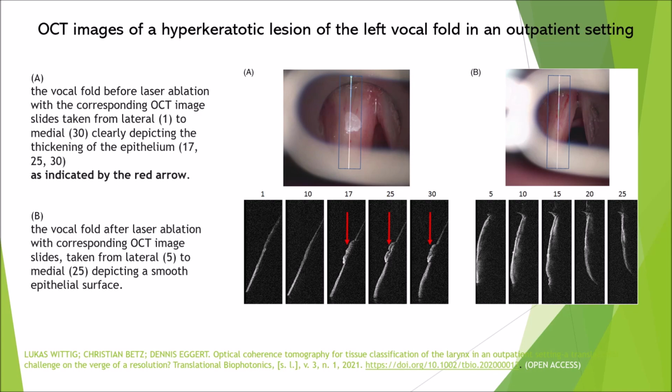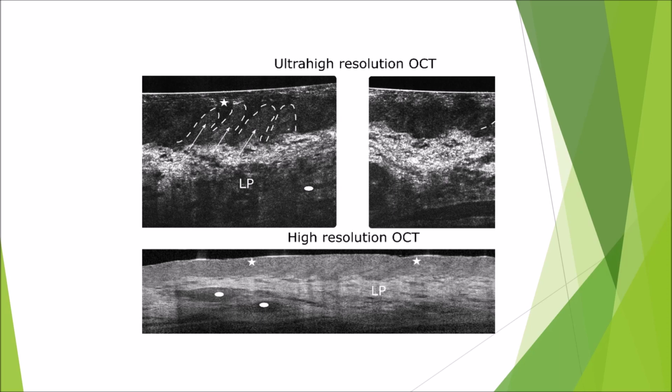In summary, ultra-high resolution OCT can be used for many benign disorders as well as for malignant disorders, documenting diagnostics and treatments effects not only to classify but also evaluate function of the larynx, especially vocal folds. The method is ideal for prospective randomized controlled trials.